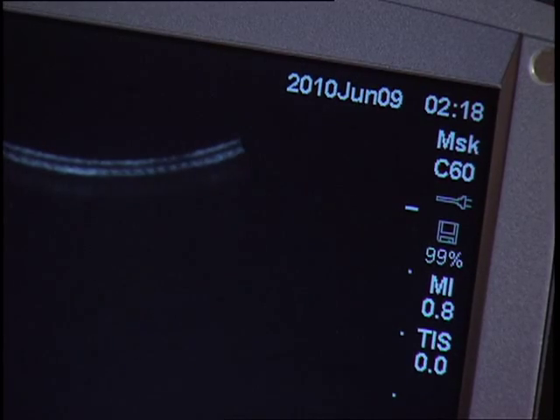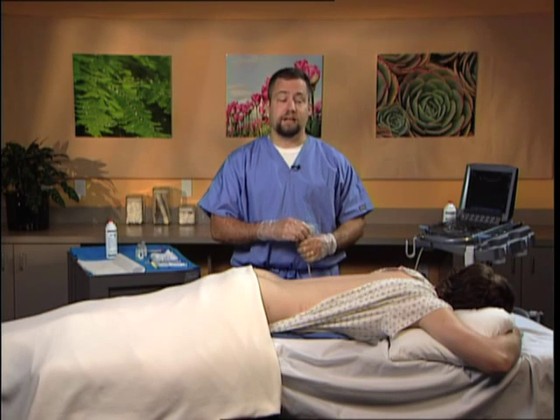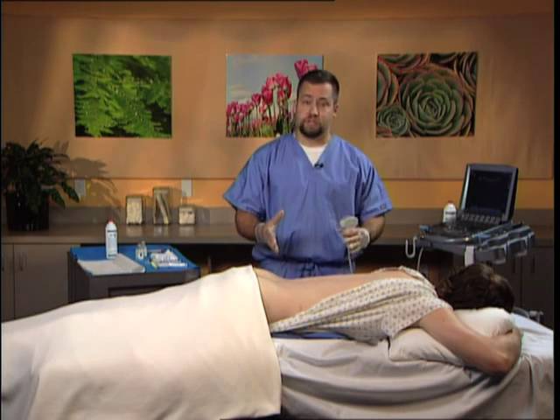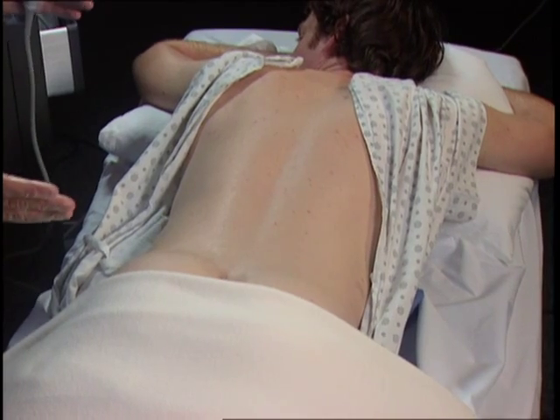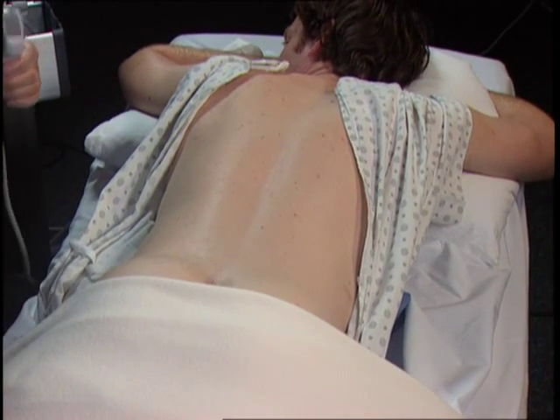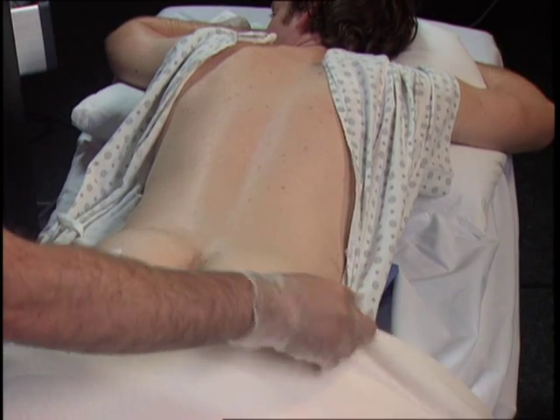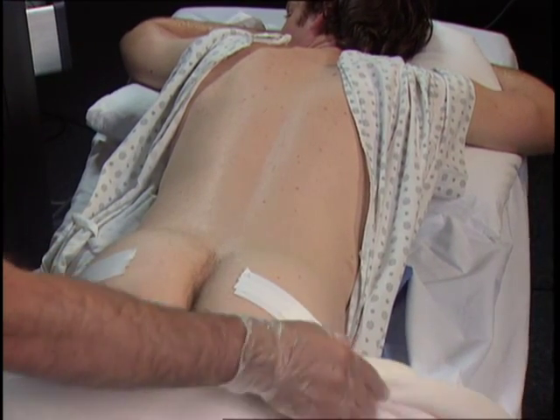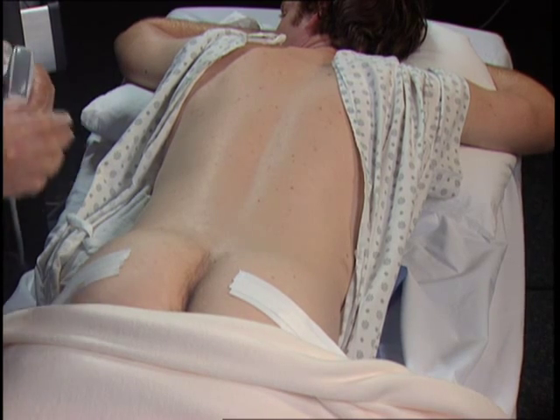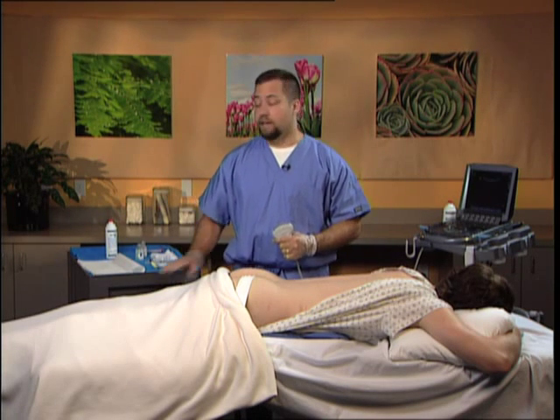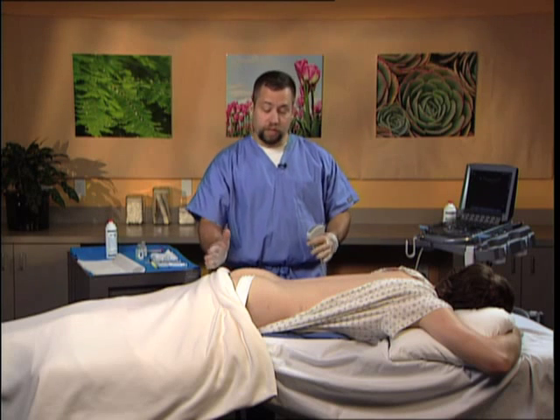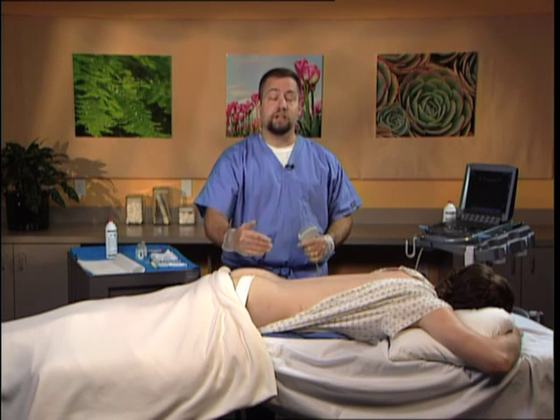We'll need to be passing a needle between two bony plates, and this setting facilitates the best view of this. In order to facilitate placement of the patient for the procedure, it is necessary to have the patient in the prone position. This is a typical position used for a lumbar epidural steroid approach. One key difference, however, is the need to move the gluteal folds so that access to the sacral hiatus — which is the key target — is facilitated. The gluteal folds have been taped down and away in a caudal fashion, providing a clean access point.